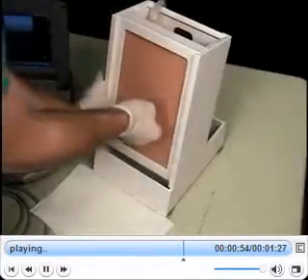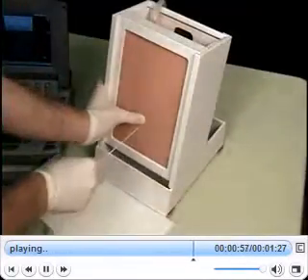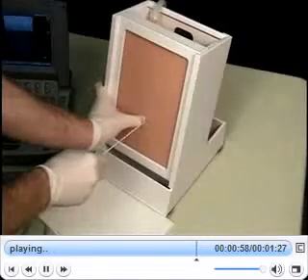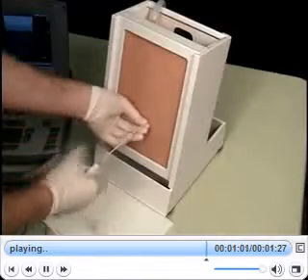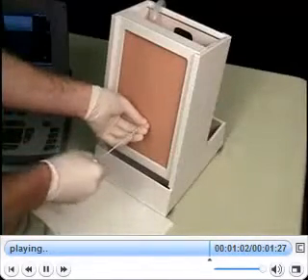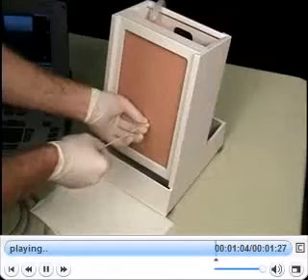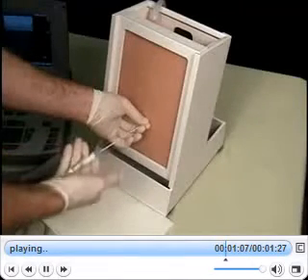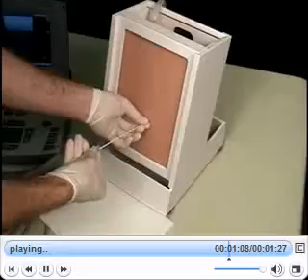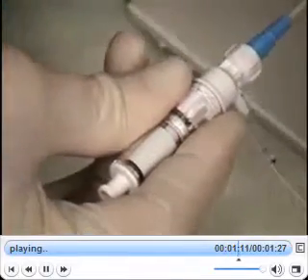The thoracentesis procedure can be completed repeatedly on the model's durable tissue, including full cannulation and the removal of fluid. During the procedure, a pop will be felt when the pleura is penetrated, and the tissue will respond to the safety centesis catheter drainage system's color safety indicator.